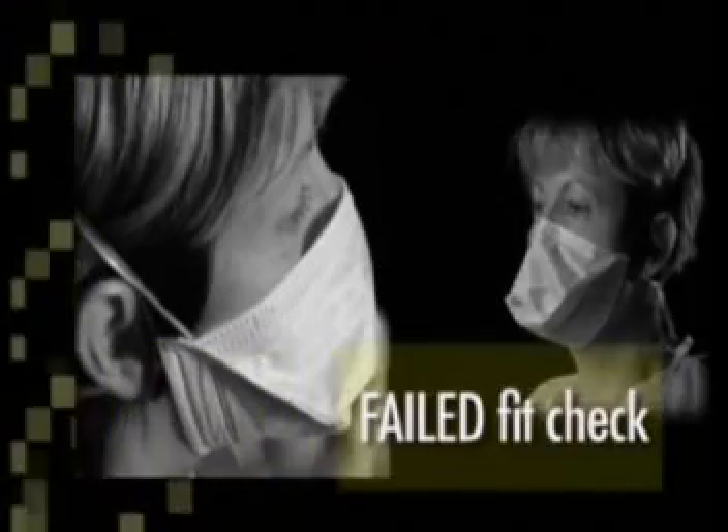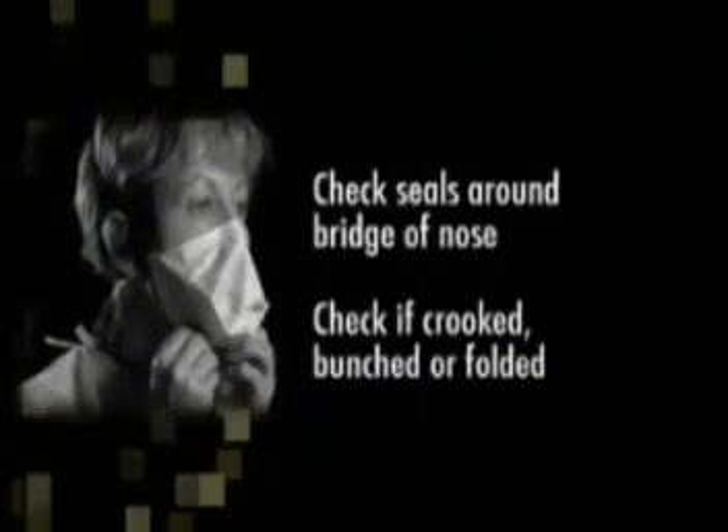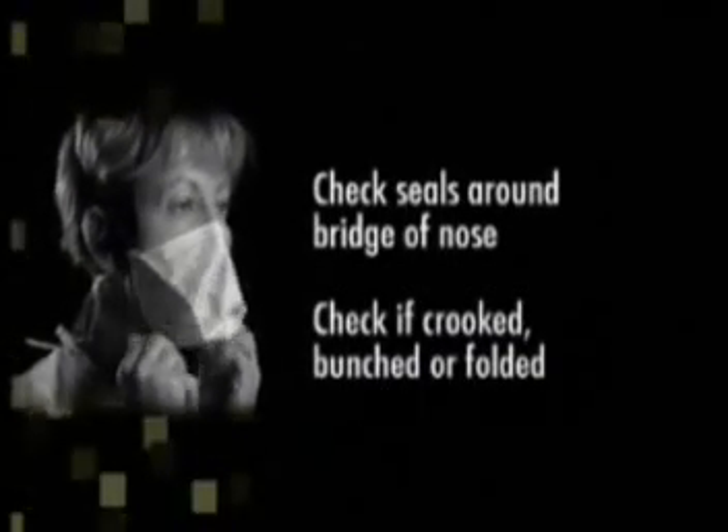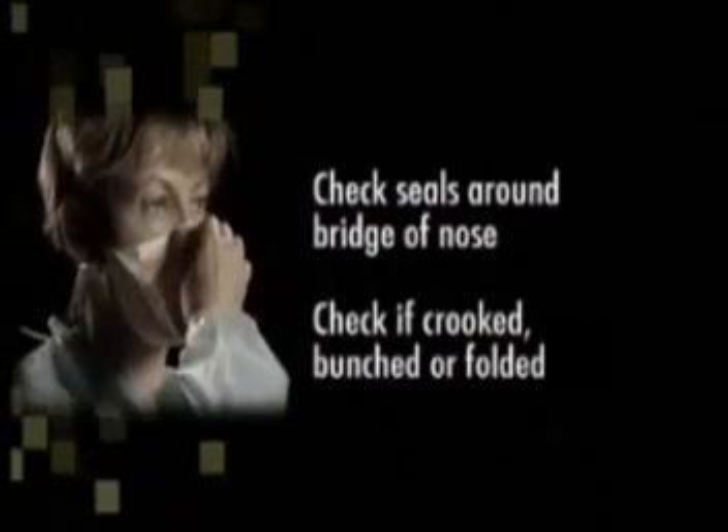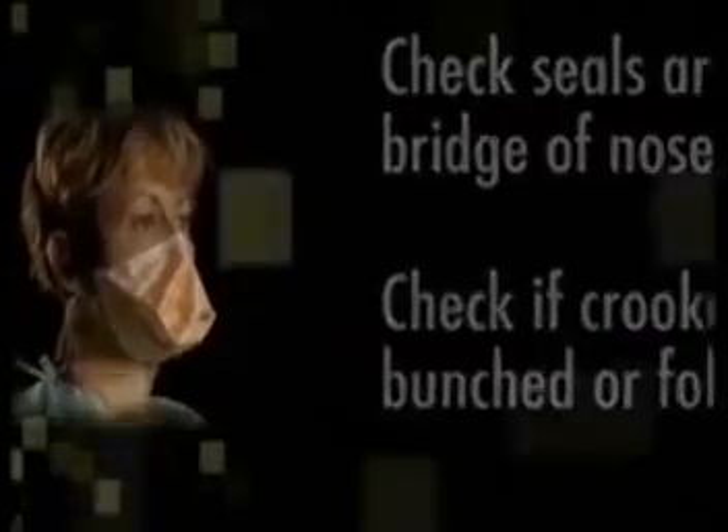If your mask does not puff out or collapse, or you feel significant air leaking around the edge, your mask has failed the fit check. You should then check that the seals around the bridge of the nose are secure and firm, that the mask isn't crooked, and that it's not bunched or folded under the chin. Once you have done this, refit and check the mask.